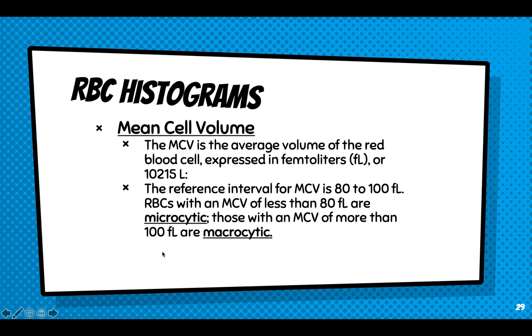So, technically, look at this one. Your reference interval is 80 to 100. How is your machine able to produce your MCV? Sir, question, how can we know the MCV? It will be produced again by your machine. Okay, I will not be asking you to compute it anyway. So, that's not part of quality yet.